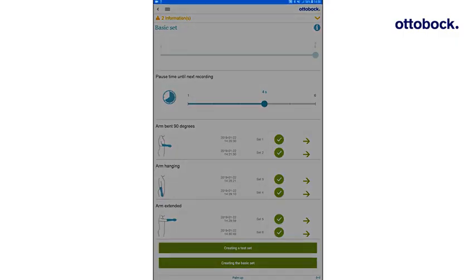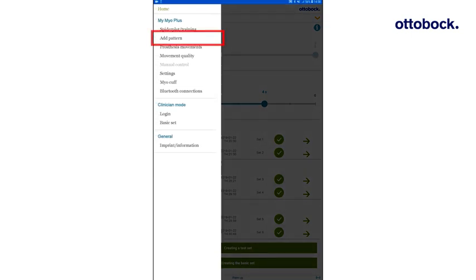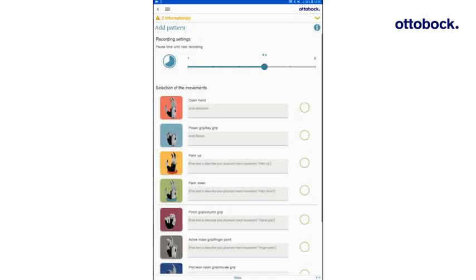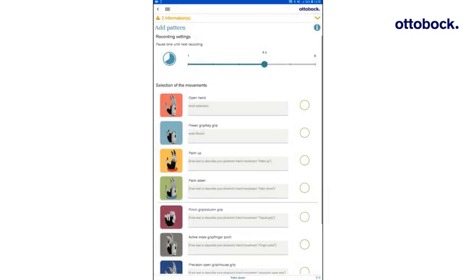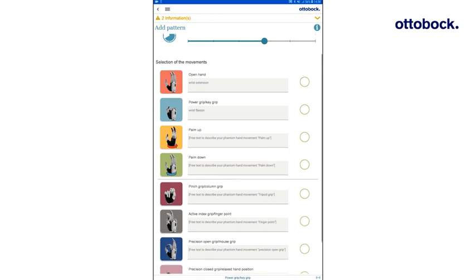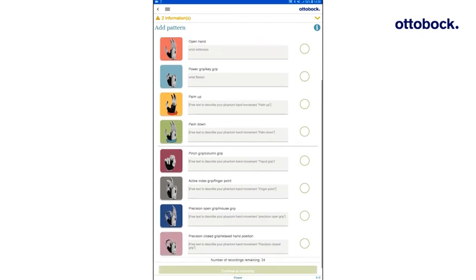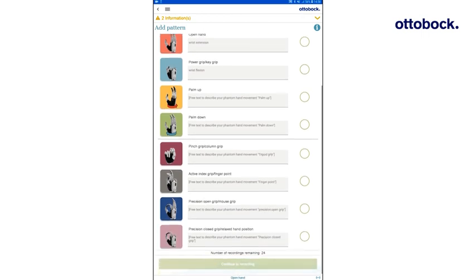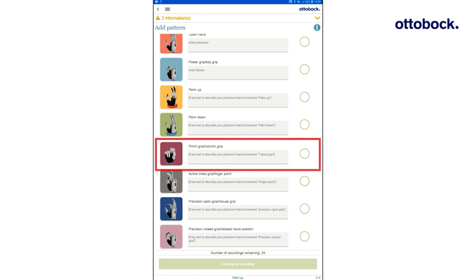To test whether the user can control additional BeBionic hand movements, navigate to the Add Pattern screen. In the Add Pattern screen, additional recordings for other available movements of the BeBionic hand can be added to the test set. Discuss with the user which BeBionic movement should be added. In this example, the pinch and column grip.